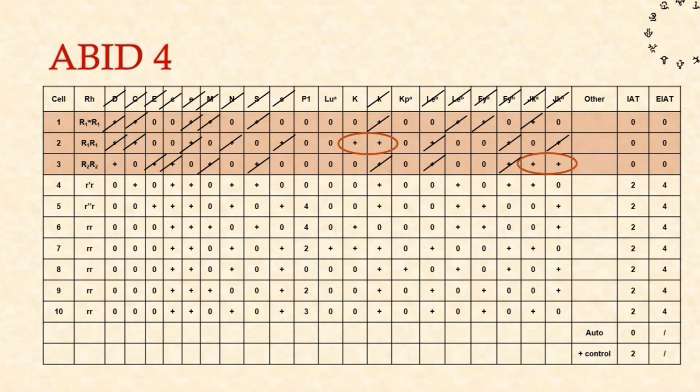Now we're looking at big K. You can exclude big K. That doesn't fall into one of those BSHEDG guideline ones where you say that it's got to be excluded on a homozygous line. It doesn't mention that about big K. So you can exclude it on a heterozygous line, but I have seen quite a number of homozygous only big Ks in my time. So I'm not saying that you can't do it because it's in the guidelines and you'll be following your guidelines, but just be mindful when you are looking for your antibodies, particularly ones that are masked by something like this.